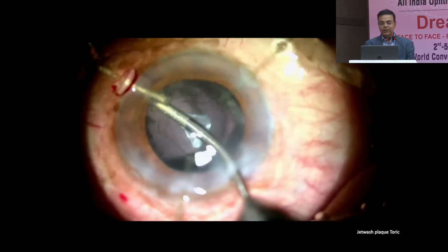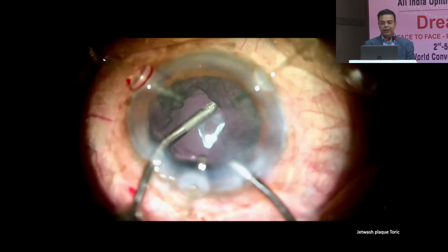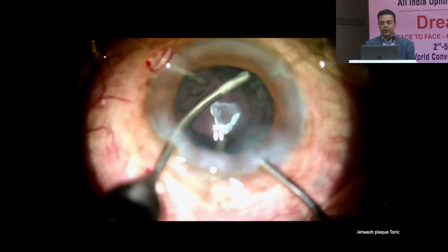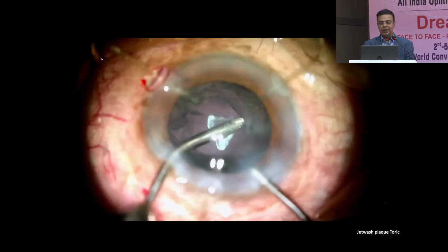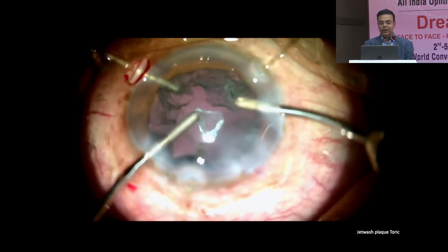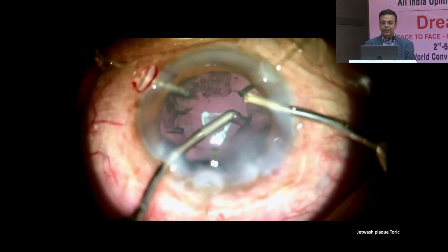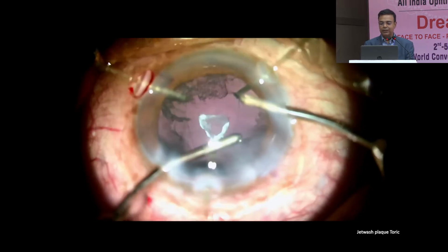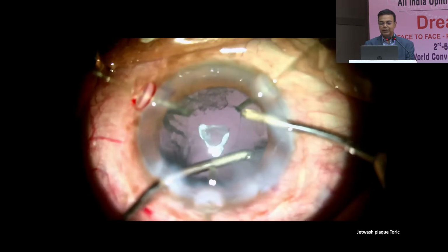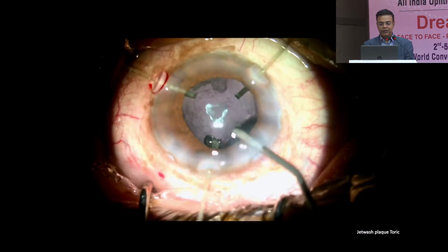This works very well because you are not trying to aspirate, you are not trying to pull, you are just setting up a passive flow, and you cannot do it from the side port because you won't set up a flow. You have to do it from the main port. Now I'm doing it from the side port but keeping the main port open. Again I have a lot of flow, so I've gone to the other side, and all 360 degrees I've managed to loosen up everything, and now in a few seconds I'm able to remove all that stuck material so nicely. It becomes very easy to get out because it's all been loosened up. This is what I use as the jet polish or the jet wash.